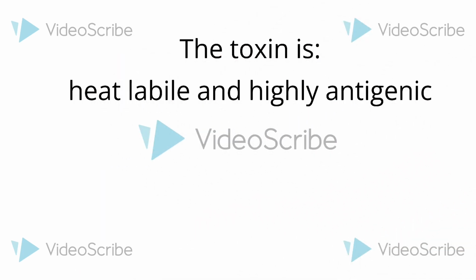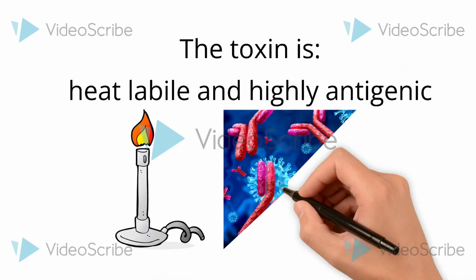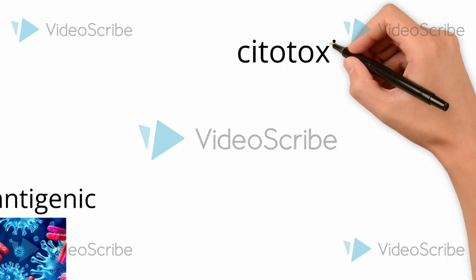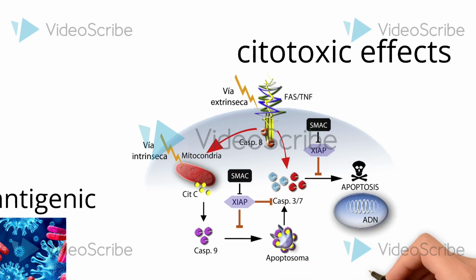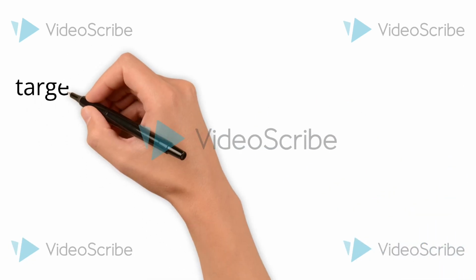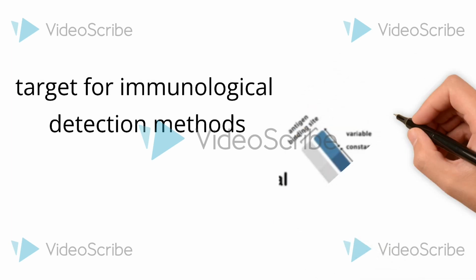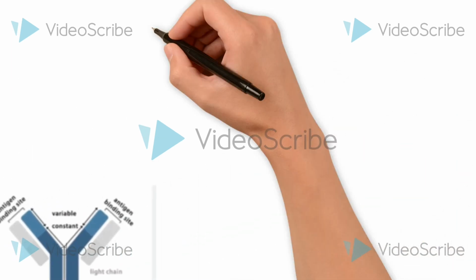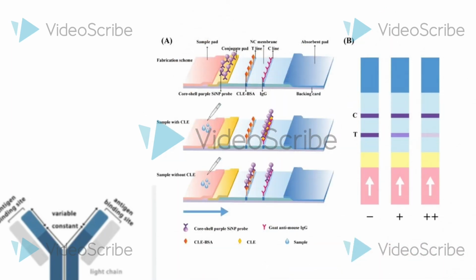Biochemically, the diphtheria toxin is heat-labile, highly antigenic, and capable of exerting cytotoxic effects at very low concentrations. These properties make it a suitable target for immunological detection methods, as it can be specifically recognized by the antitoxin antibodies used in the diagnostic assay.